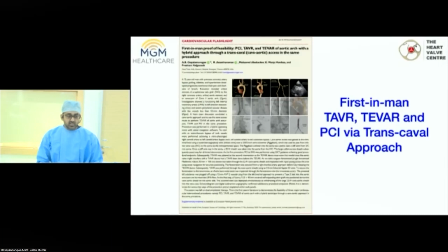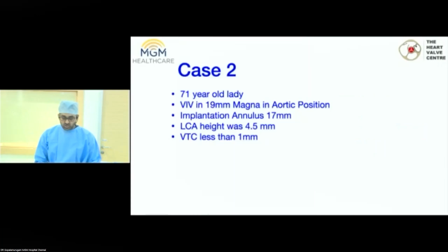And that was, in fact, first in man, TAVR, TEVAR, and PCI proof of concept through a transcaval approach. So we published it in the European Heart Journal. Case 2 will be another electrosurgery case.